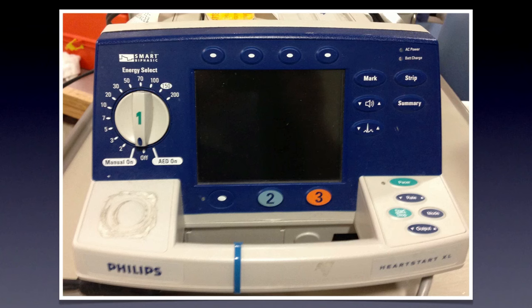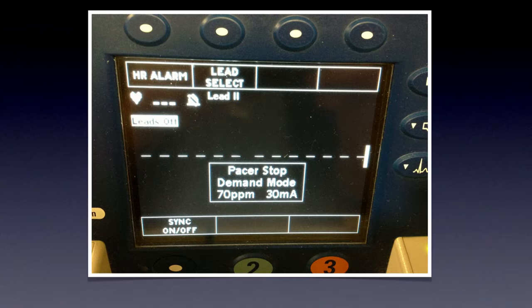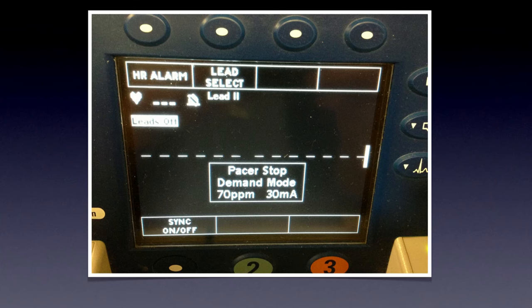Take your defibrillator/pacing system and figure out where your pacer controls are. On this system, the pacer controls are on the handle on the right side of your screen, outlined in red. There are several key functions. The first step is to turn the pacer function on. When you do that, the screen appears with a box showing pacer information: pacer stop, meaning it's not actively pacing, the mode, pulses per minute, and the power output.